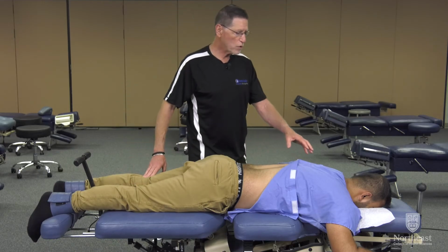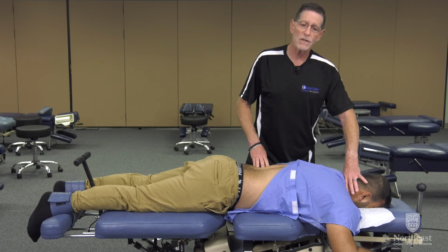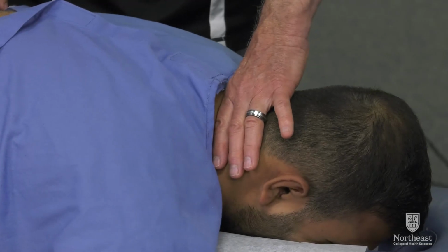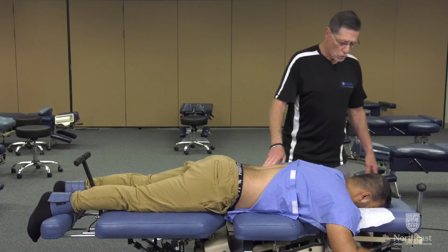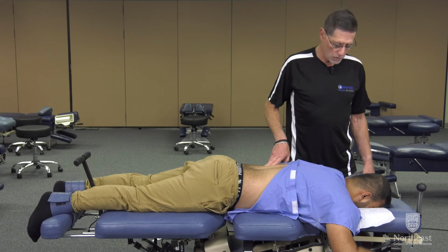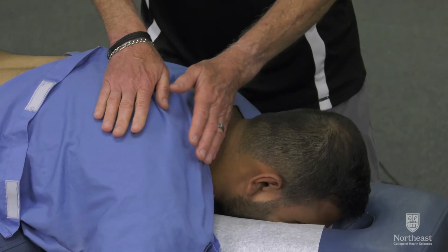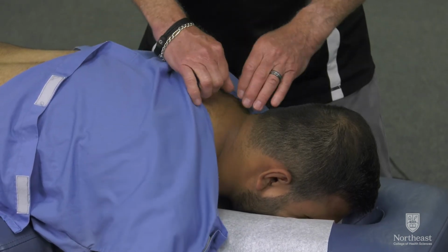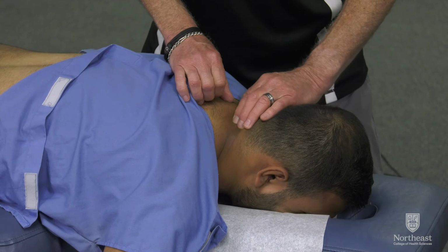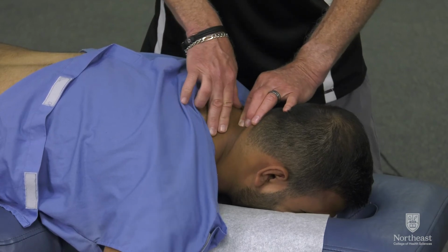Similarly, we can treat a patient with a problem with a disc in the cervical spine or the neck by applying this technique in the cervical region. So the way this is done in the cervical region, let's say this would be for a patient with a discogenic radiculopathy into either the right or left upper extremity, we would find the level that we've identified as the culprit. Let's say it's C5.